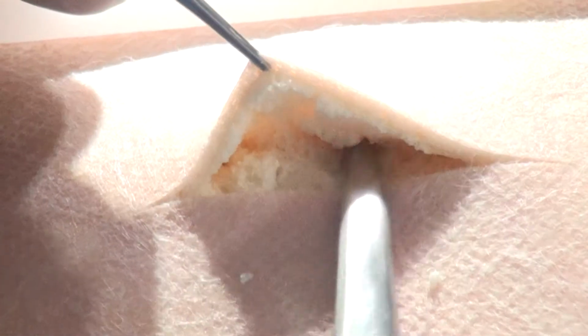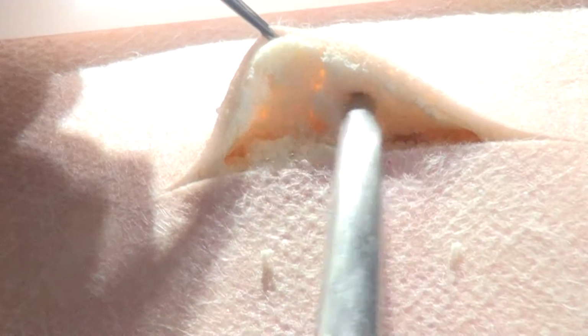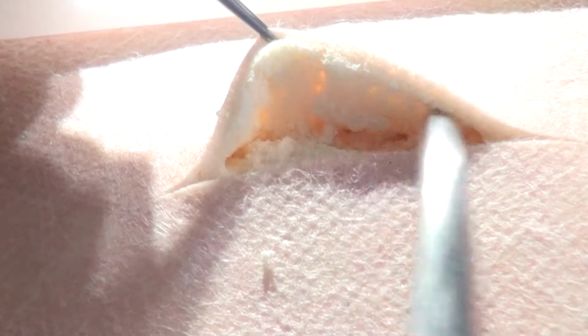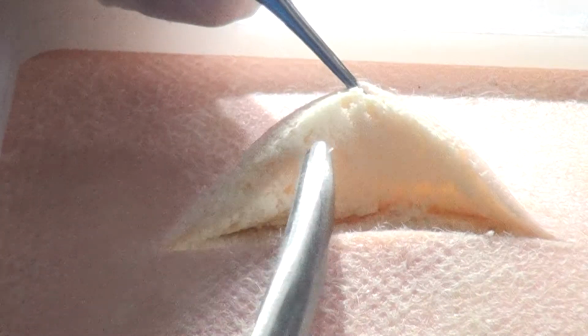Now, for postgraduates, I always ask them. Now, I'm showing you the flap here. Can you see this, please? Yes, sir. Now, the other side was blade. Can you see this, please? Yes, sir. Which one is better?